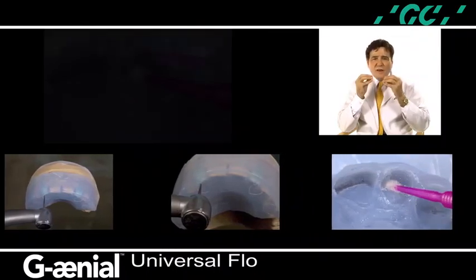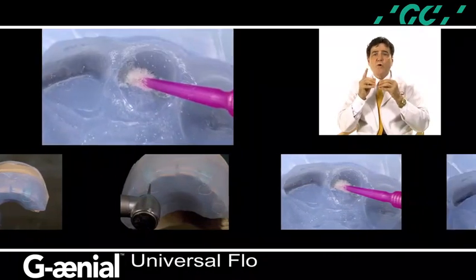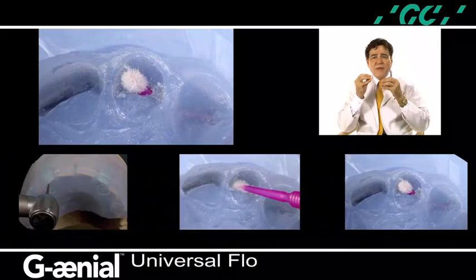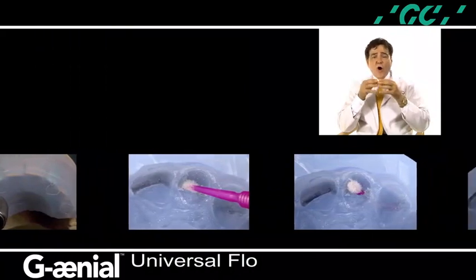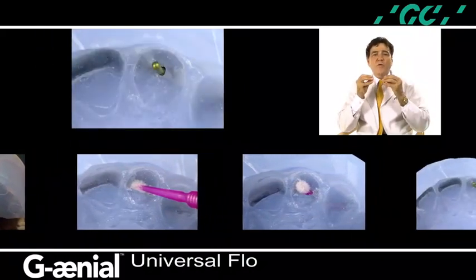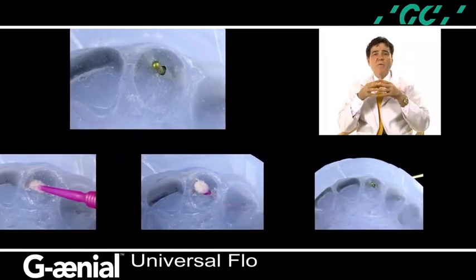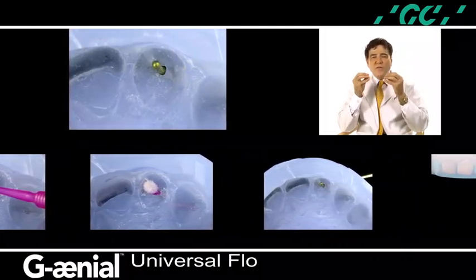It is important to clean the internal surface of the impression and the orifices with an applicator tip to prevent silicone debris contamination of the composite material. Also, the orifice should be inspected with a small tipped instrument to ensure a clear passage of the composite material, and remember to enlarge the orifice to the size of the syringe tip.